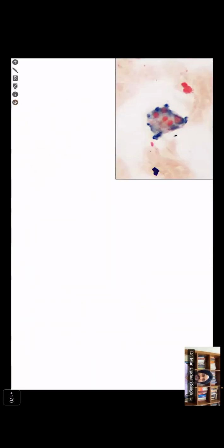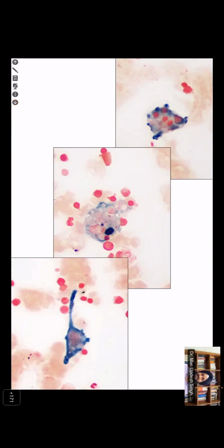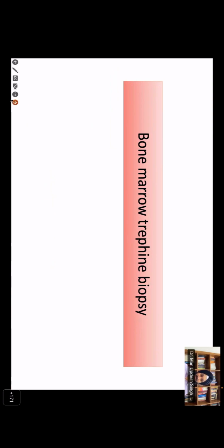If the iron is loaded in the histiocytes, it could be a good stain to localize histiocytes with hemophagocytosis. You identify the histiocyte with Pearl stain and too many nuclei in the cytoplasm. So in a patient with high storage iron content, you could see how many cells it has engulfed. The Pearl stain might help you to identify these histiocytes in the trails, showing hemophagocytosis. That's just a sort of clue there.